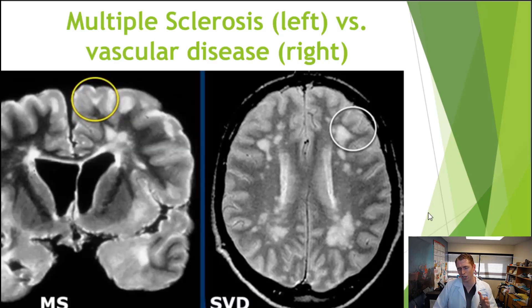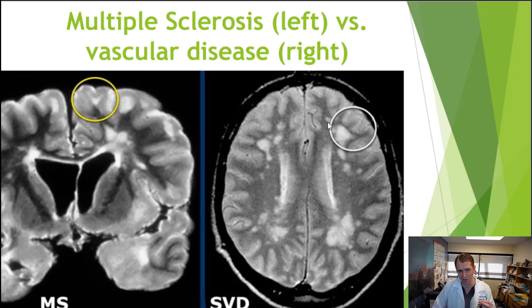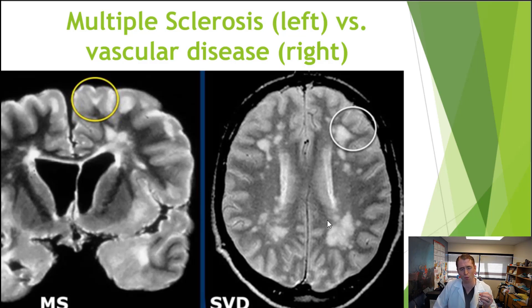It can be a bit tricky, so let's compare and contrast some distinctive features one more time. We have multiple sclerosis on the left and vascular disease on the right. In MS, lesions directly touch the cortex as juxtacortical lesions, whereas in vascular disease there's a clear area of normal tissue between the cortex and subcortical white matter. Periventricular lesions with Dawson's fingers touch the ventricles in MS, whereas the periventricular area is relatively spared in vascular disease. MS lesions are more distinctive and well-demarcated — a very sharp transition between diseased and normal white matter seen on autopsy — whereas vascular lesions are patchier and more indistinct.